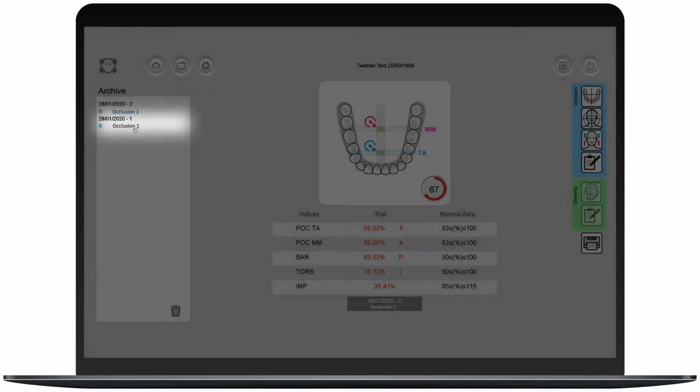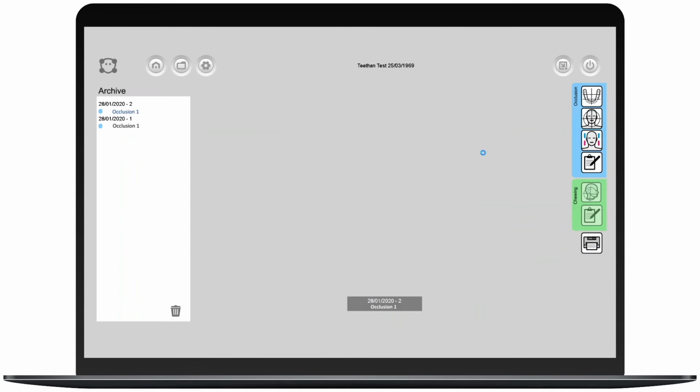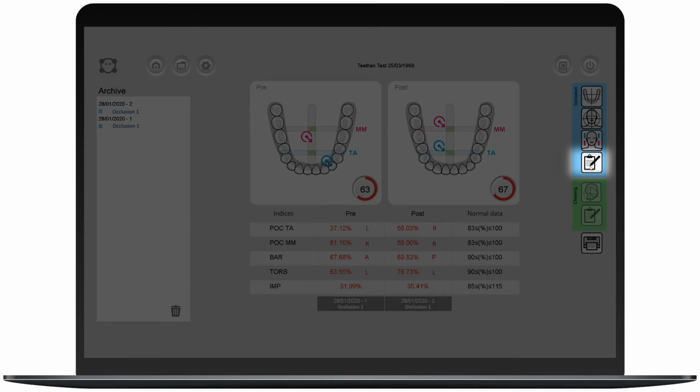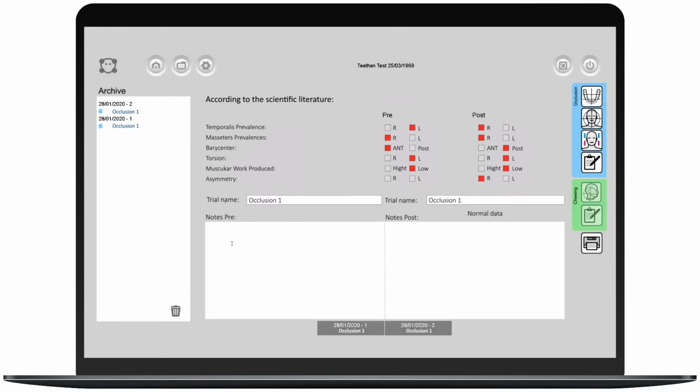If you want to compare the results of other tests acquired, simply double-click on the test, then drag and drop it to the center of the screen. The software automatically recognizes which test has been carried out before and after. Before exporting the report, it is possible to type notes regarding the patient or the treatment.